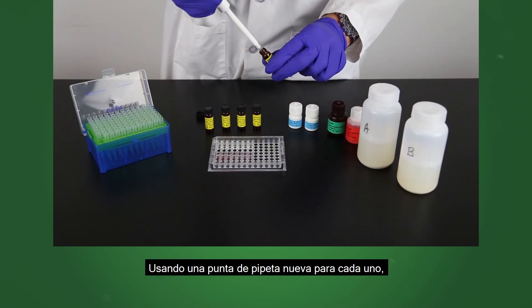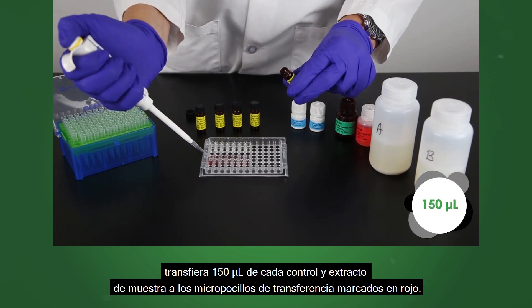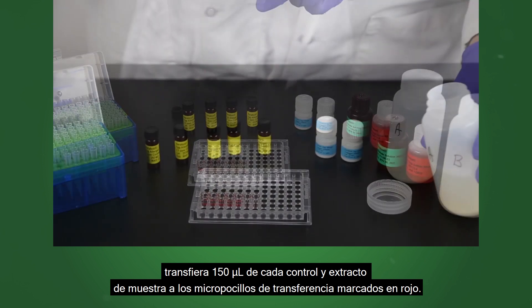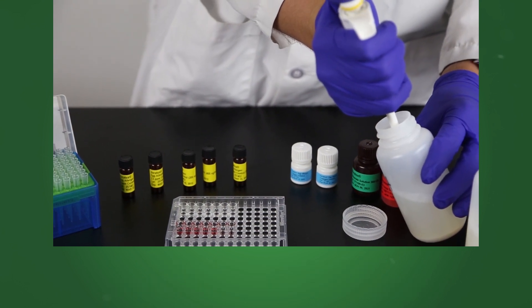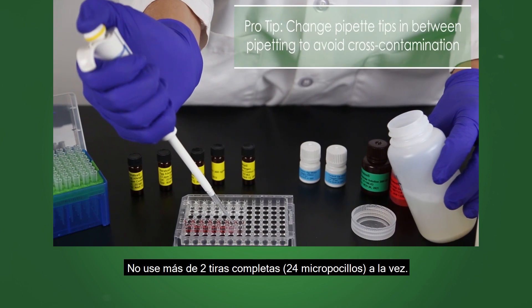Using a new pipette tip for each, transfer 150 microliters of each control and sample extract to the appropriate red marked transfer wells. Do not use more than two full strips, 24 wells, at one time.